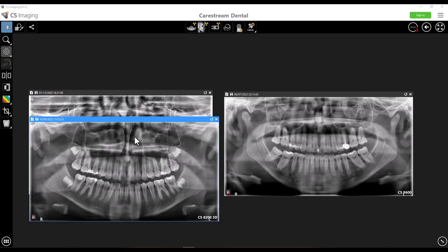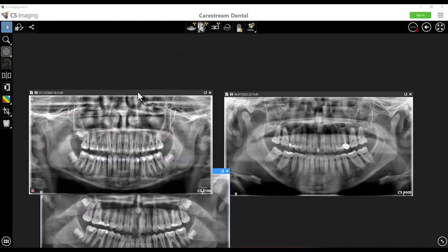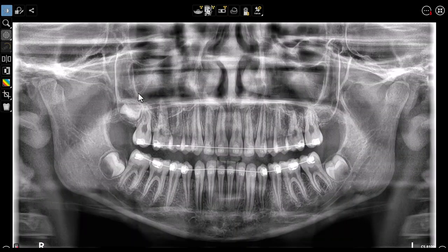When the tongue is properly placed along the roof of the mouth — this image is taken from the CS8100 pan — you can see we don't have those same radiolucencies around the maxillary apices. It does make a big difference for really nice quality diagnostic images.